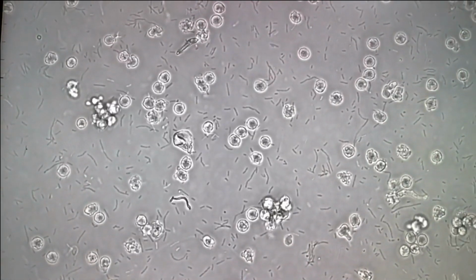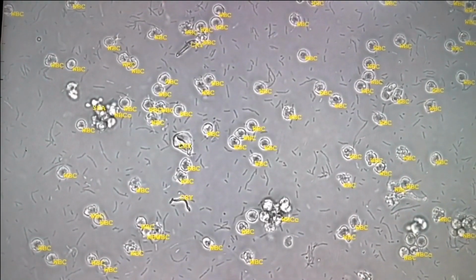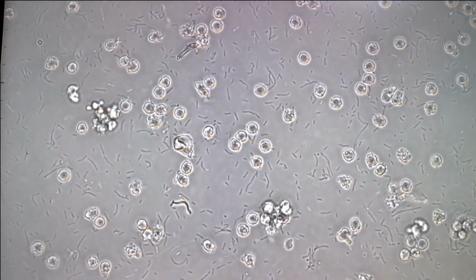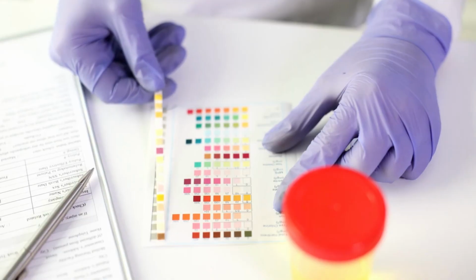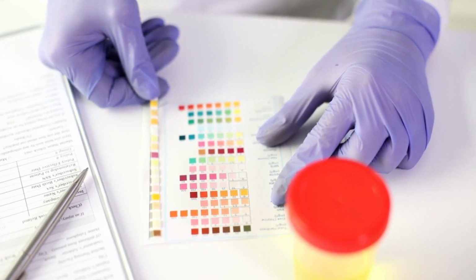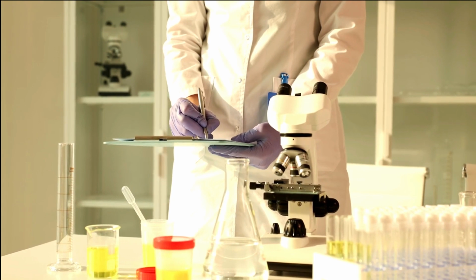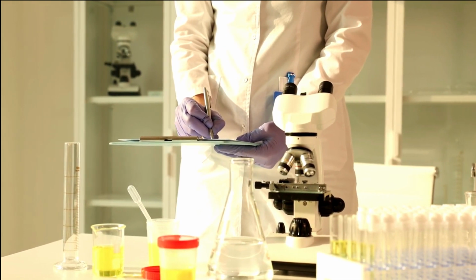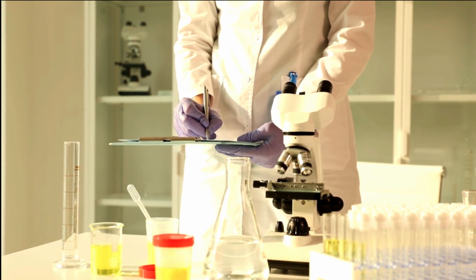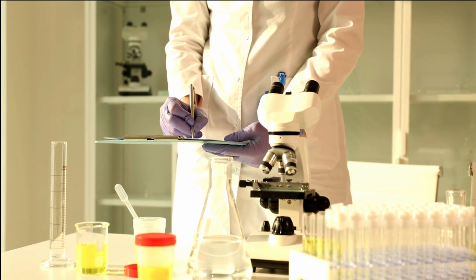Let's talk about white blood cells, or WBCs. WBCs are another indicator, especially when it comes to diagnosing infections. A chemical pad on the dipstick will change color to indicate whether WBCs are present in the urine. This will lead the scientist towards performing a microscopic examination to search for WBCs in the urine. A microscopic examination helps detect the presence of WBCs in urine, confirming that there is some sort of urinary infection.